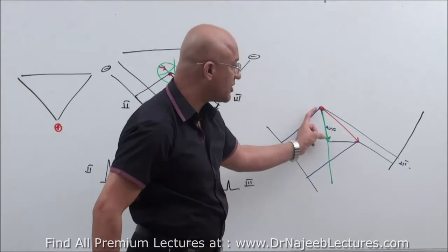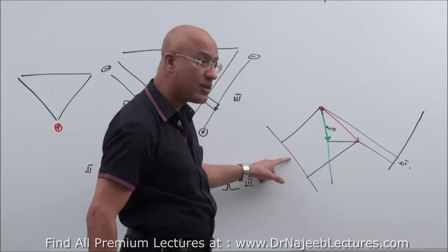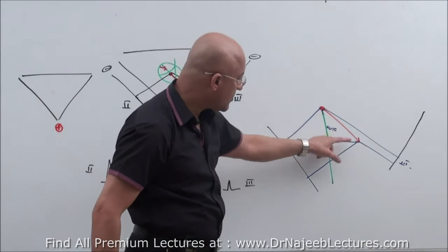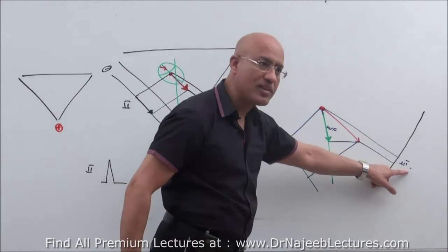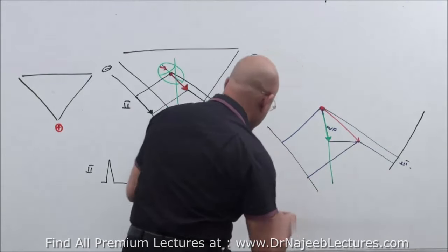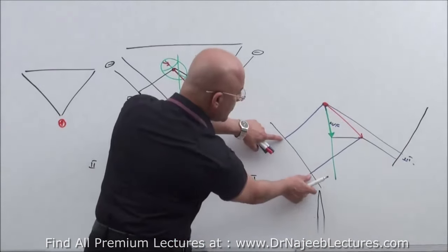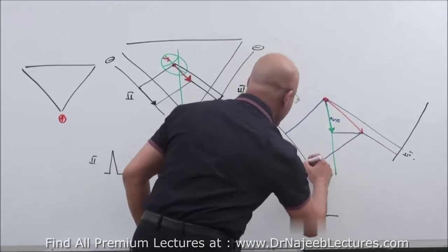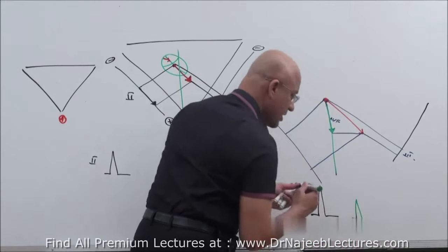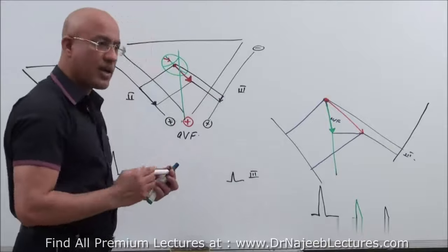So this is the true electrical activity, right? You can look at it through lead number 2: maximum amplitude of QRS. AVF less, lead number 3 least. You understand it? So this is lead number 2, if its amplitude of QRS is like that here, right? I will make AVF a different color. It is AVF. And what is that again? Lead number 3. Is that clear?